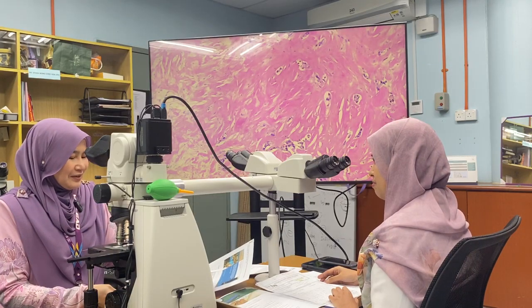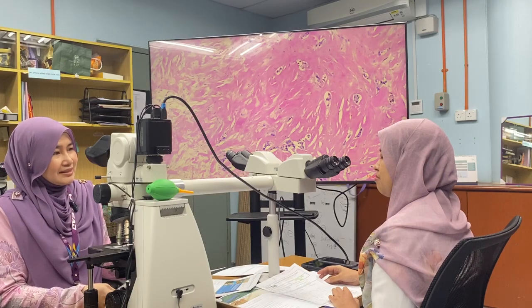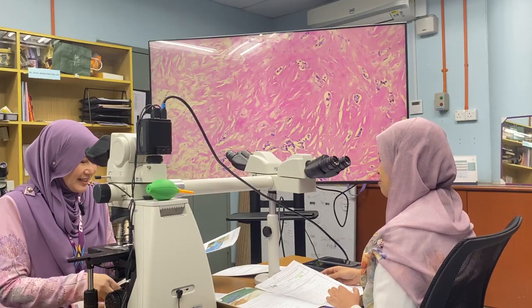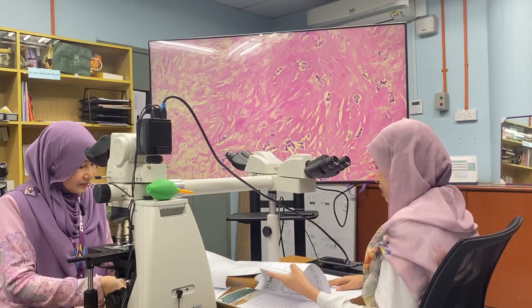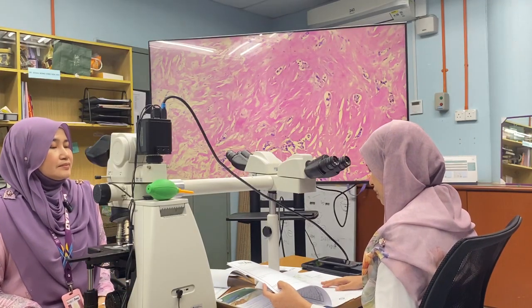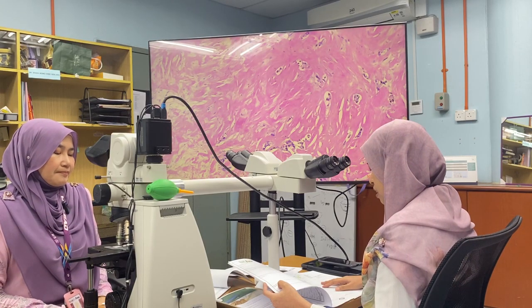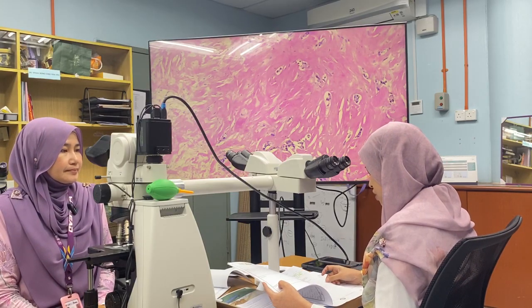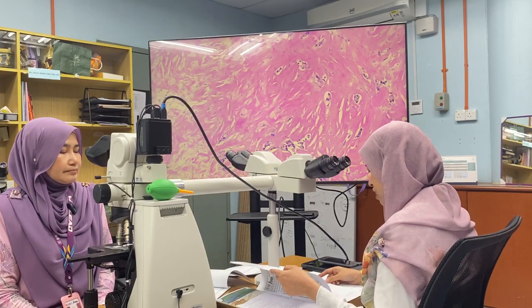I found that you have selected one case to present for our case-based discussion today. All right, let's start with the case. This is a 47-year-old lady, known case of breast carcinoma, diagnosed in 2024. At that time, the clinical stage was T4B N2 M0. She was previously positive for ER, PR and HER2, so she underwent neoadjuvant chemotherapy, and post-chemo CT shows a smaller size lesion.